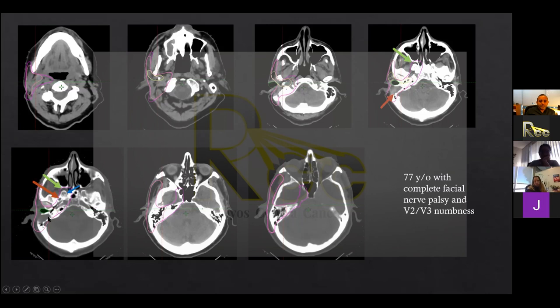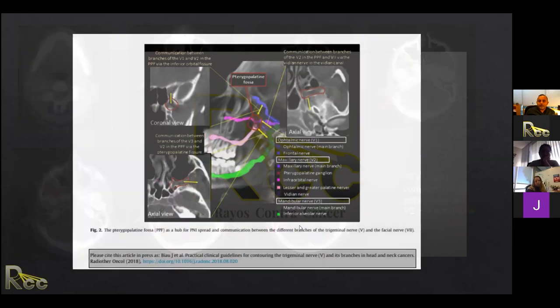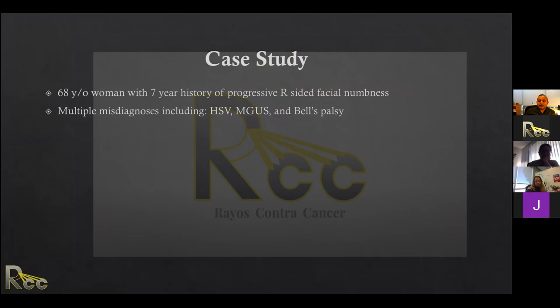And then you can see, in this patient, covering the connections, not only did I cover this patient's tumor, gone into V3 here, but also to V2. So in this patient, you can see we covered not only foramen ovale, but also foramen rotundum and pterygopalatine fossa right here. And here you can see we covered Meckel's cave, cavernous sinus in this patient. So you can see what these volumes look like. And so there is morbidity here, right? This patient is going to lose hearing from radiation. So you can see that these are the paths that you treat.